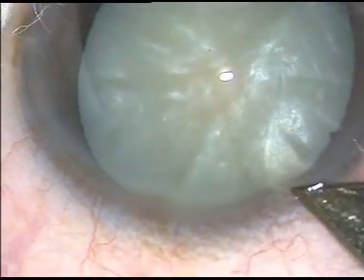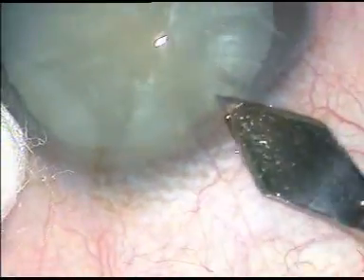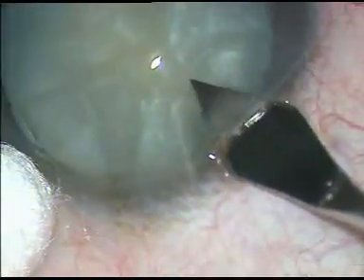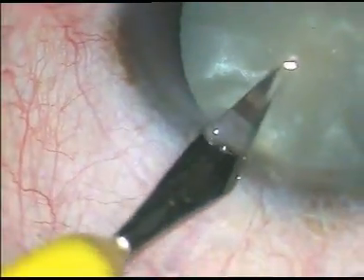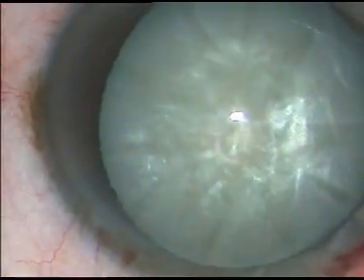This is phacoemulsification of a soft intumescent cataract. The main incision is being given at around 11 o'clock with a 2.8 mm keratome. One side port is made at 1 o'clock.